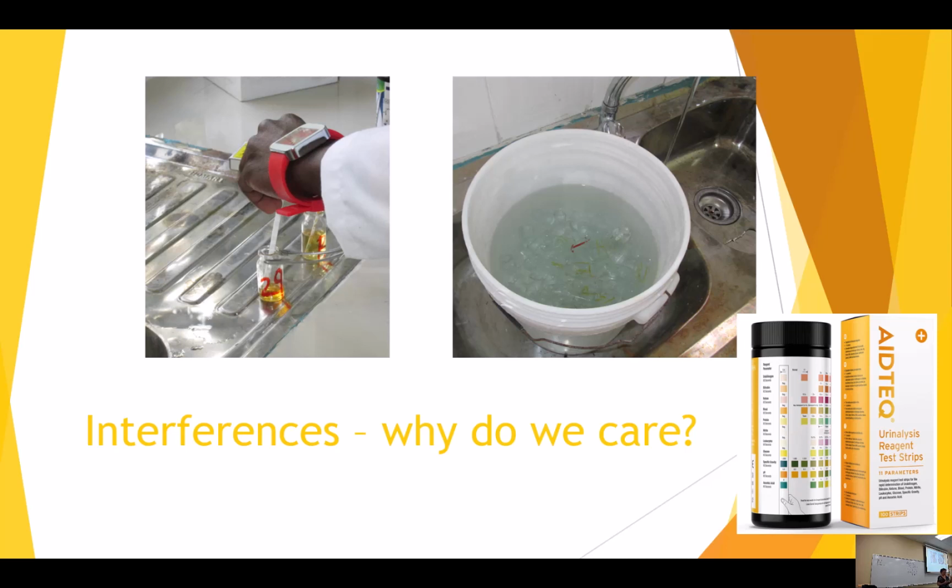We don't use bleach much in the lab because it was so corrosive to our counters and our equipment, but some labs might still use bleach as a cleaning agent, so it's important to know. The other thing I want to point out are these strips here.